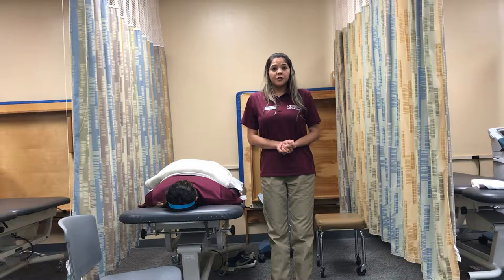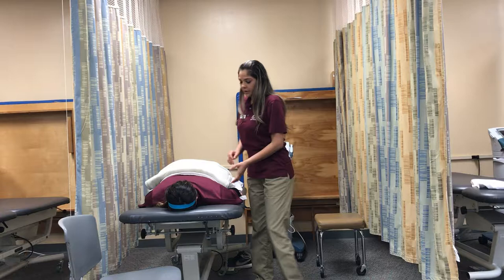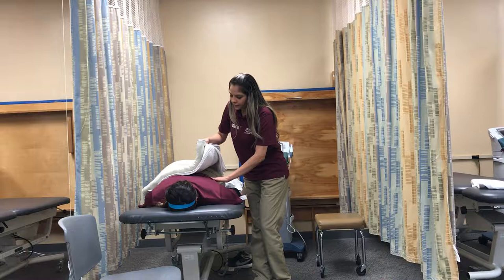The duration of the treatment is 15 minutes. Each five minutes, I will reassess the skin. Five minutes have passed, so I will reassess the skin.